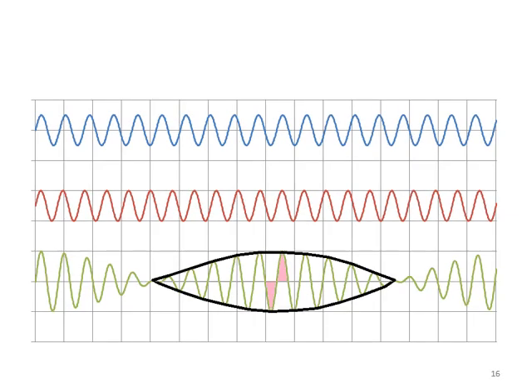Here the beat or envelope is highlighted under the black borders. As you can see in this beat, each sinusoidal wave is progressively increasing in intensity and then progressively decreasing in intensity, and it is the middle part of the wave where the peak intensities are present, and these intensities are actually responsible for producing the peripheral nerve stimulation.